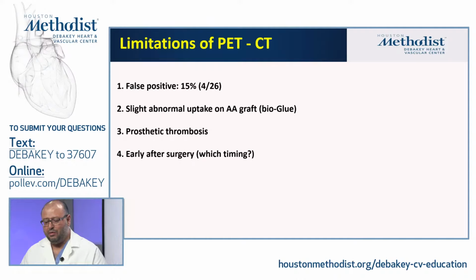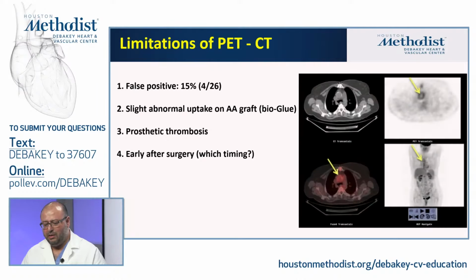Sometimes with pure thrombosis, there is a small element of inflammation with thrombosis, which could give you a similar picture. And then it's very early after surgery, still within the very early phase, although there have been some reports that people were successful also within a month after surgery. And again, you have to use it here for its negative predictive value. So if it looks negative, you're pretty confident that there is nothing, but if it is positive, then it doesn't mean much. And here's one example of the low-grade inflammation after surgery that some of these patients have.